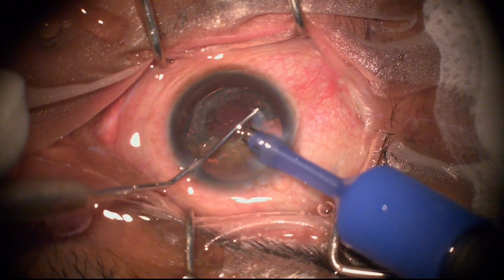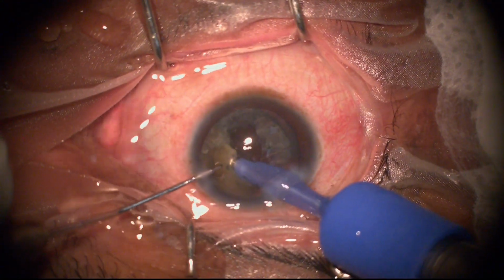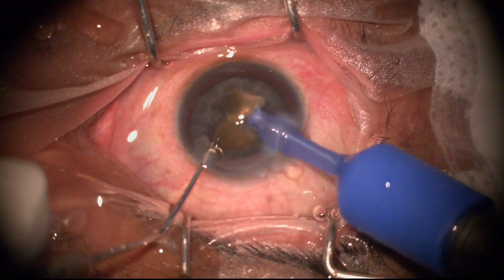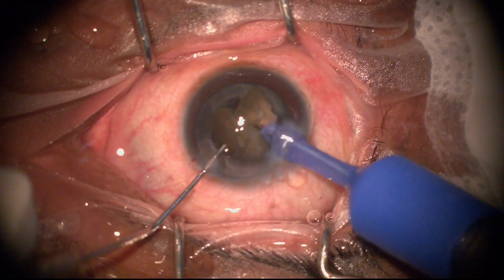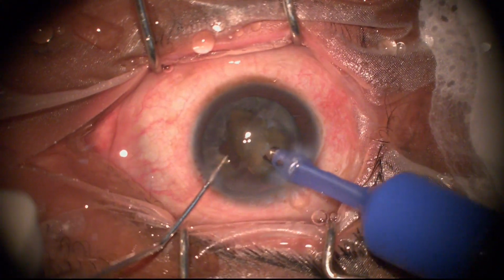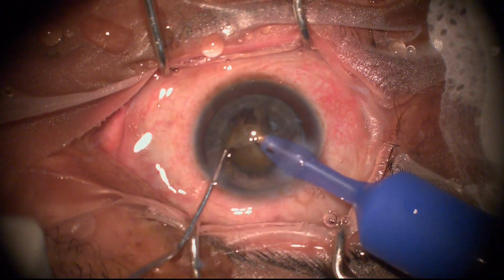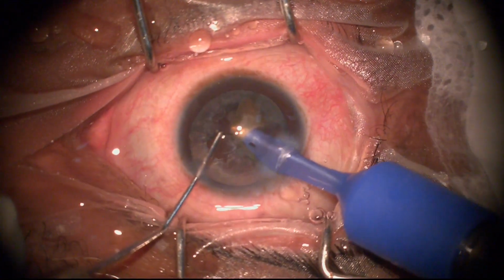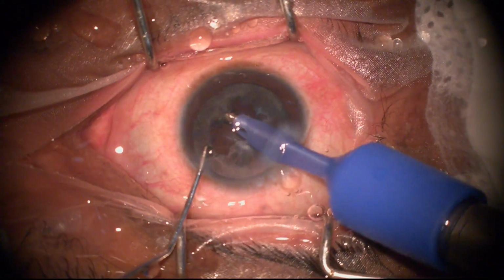Like for example, if I'm looking here and operating here. And because it gives you a 3D view with depth perception, it can be done. So have you heard of this? There's also a further extension, where we can operate from somewhere else and the patient is somewhere else. But do you think you would advocate that? Yes. There are so many technical hiccups.